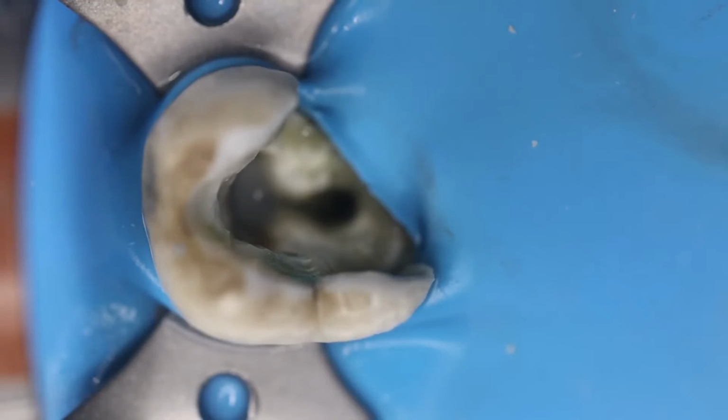Again, and now for the distal part you can do it again. Although the orifices over here are already enlarged so wide that we don't use them, this is just a demonstration of how you can use them.